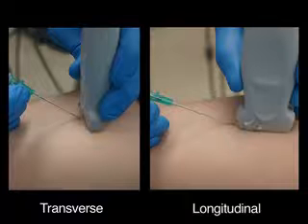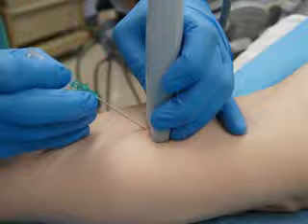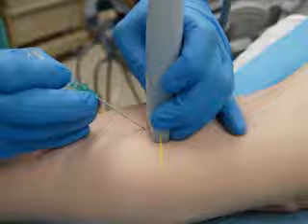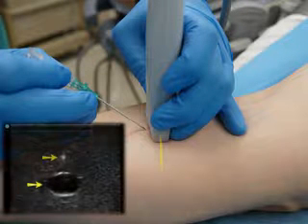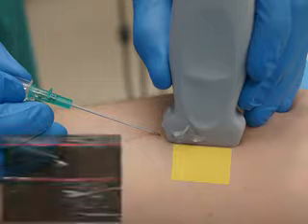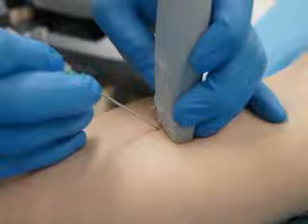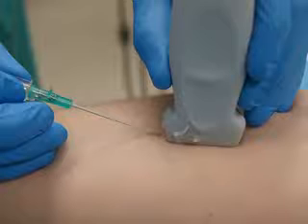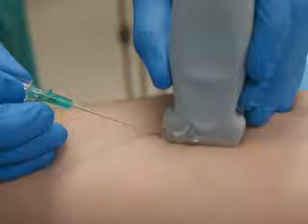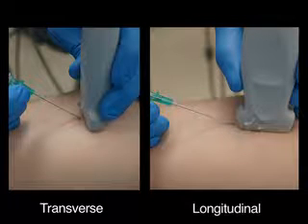There are two commonly used techniques for ultrasound-guided vascular access, the transverse technique and the longitudinal or in-plane technique. Transverse or longitudinal describes the orientation of the ultrasound plane with respect to the vein and the needle. In the transverse technique, the ultrasound plane is transverse to the vein and the needle, so the vein is circular and the needle is a single bright dot. With the longitudinal technique, the long axis of the vein and needle are in line with the ultrasound plane, so the vein appears as a tubular structure and the entire needle is visualized. The transverse technique gives less information, but is easier to learn and is recommended for novices. The longitudinal technique is more difficult to learn, but is preferred by many experienced providers. We will demonstrate these techniques and explain why it is best to learn both.